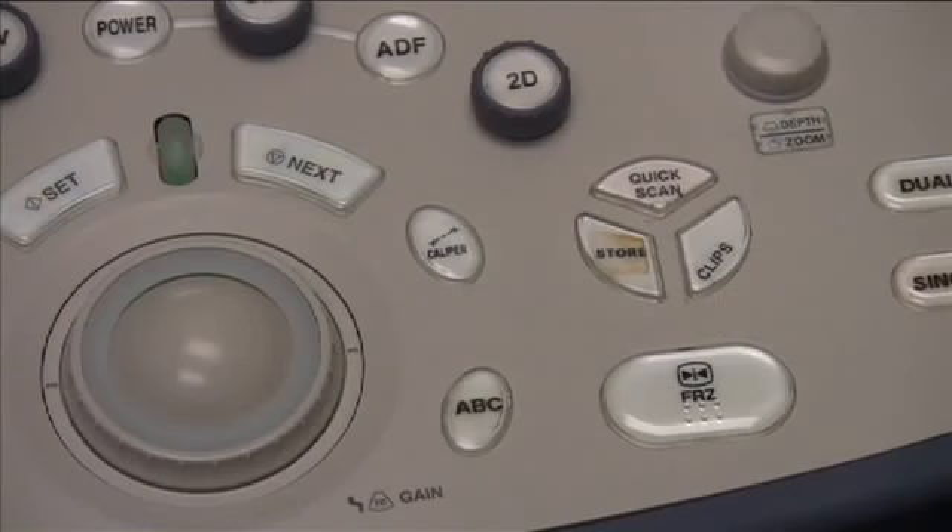To capture a Cine image, scan for three seconds and then press the Clips button. Your previous three seconds of scanning are now saved as a movie image.